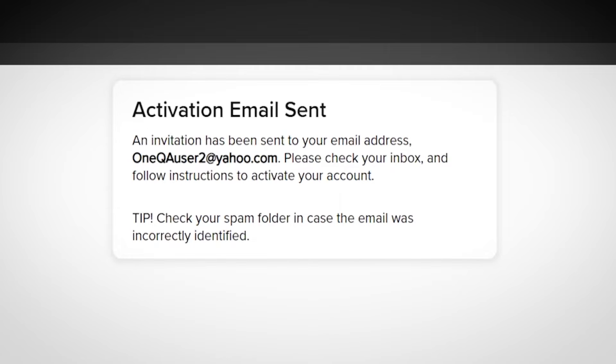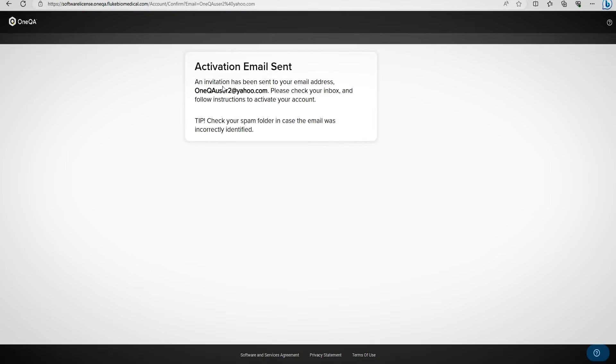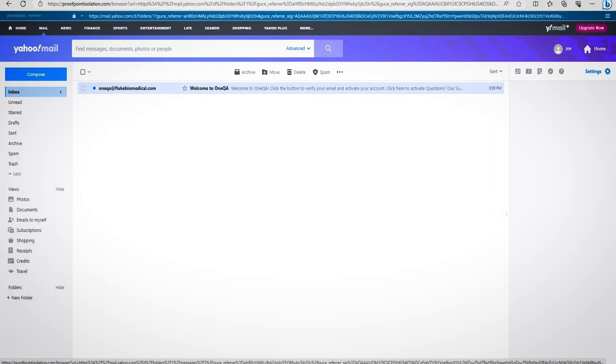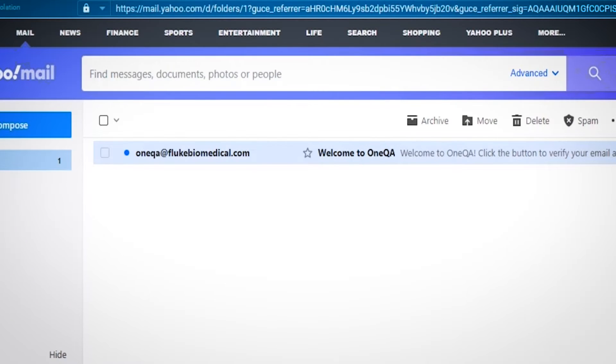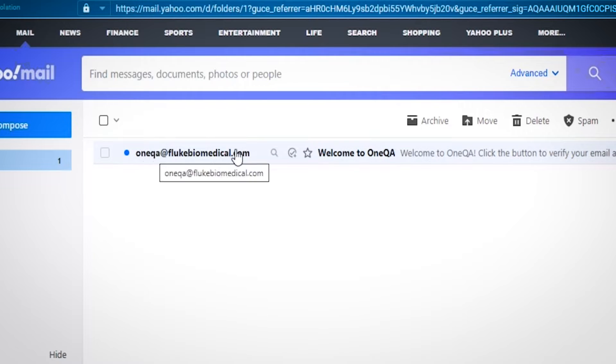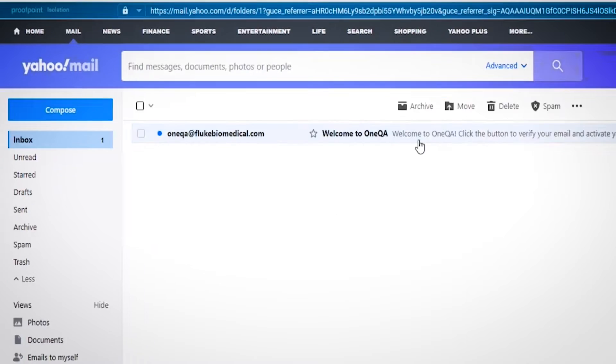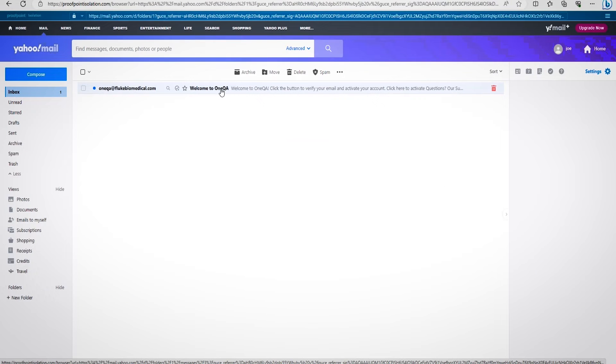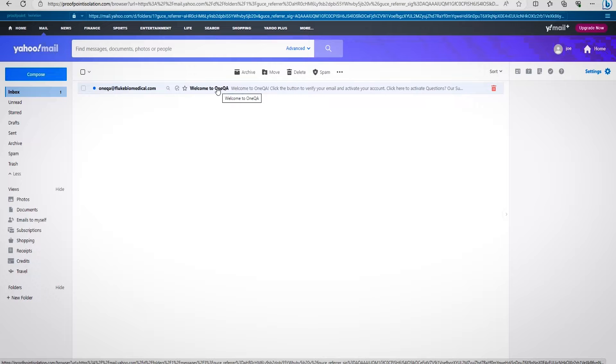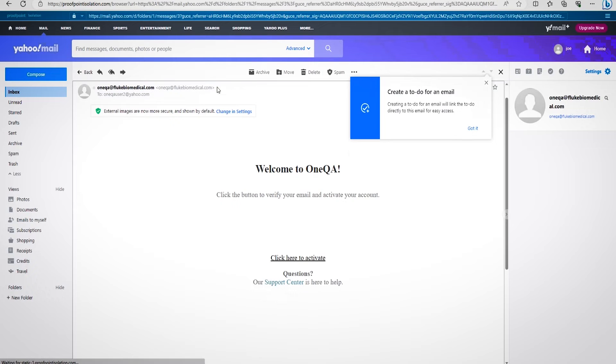An email will be sent to the address you provided during registration, so let's check our email. Now that we've accessed our email account, let's look for an email from OneQA at Fluke Biomedical. If it's not in your inbox, please check your spam folder. You should receive the activation email within 5 to 10 minutes after registering your account.